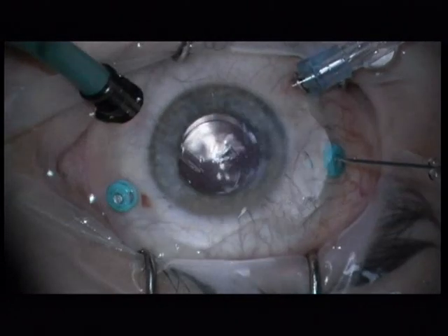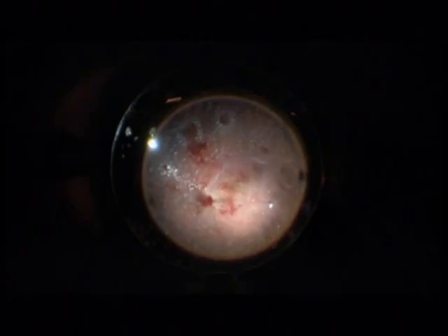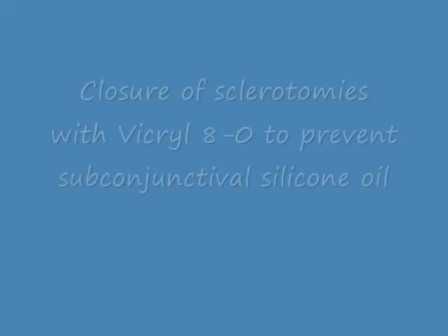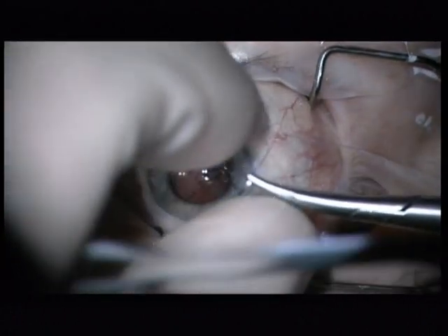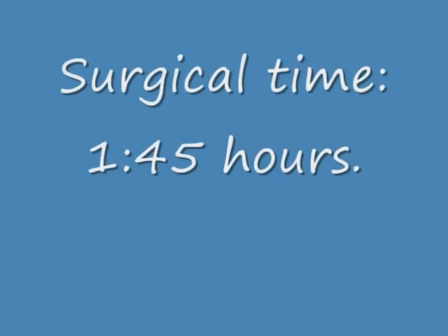Next step is injection of 0.2 milliliter Avastin. Next step is injection of 1,000 centistoke silicone oil. This is the final air bubble. I close the sclerotomies with a Vicryl 8-0 suture. The surgical time is 1 hour 45 minutes.